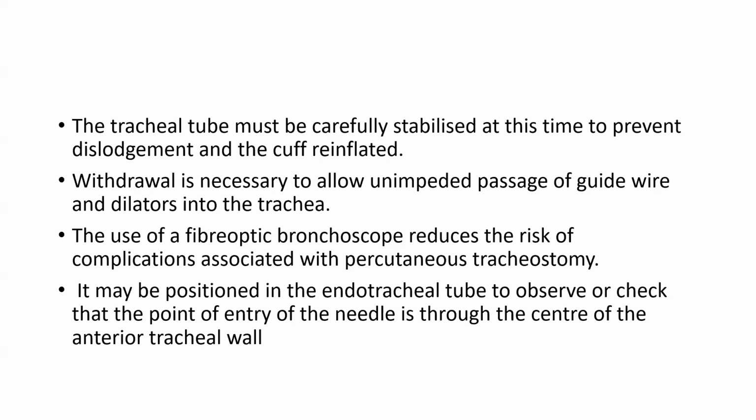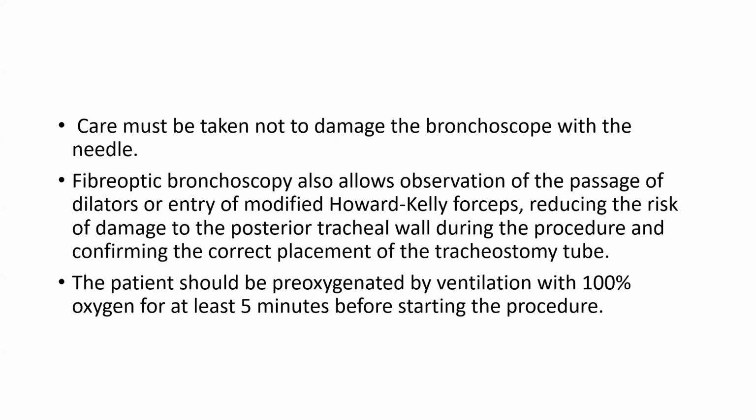The use of fiber optic bronchoscopy reduces the risk of complications associated with percutaneous tracheostomy. It may be positioned in the endotracheal tube to check that the point of entry of the needle is through the center of the anterior tracheal wall. Care must be taken not to damage the bronchoscope with the needle. Fiber optic bronchoscopy also allows observation of the passage of the dilator or entry of modified Howard Kelly forceps, reducing the risk of damage to the posterior tracheal wall during the procedure and confirming the correct placement of the tracheostomy tube.